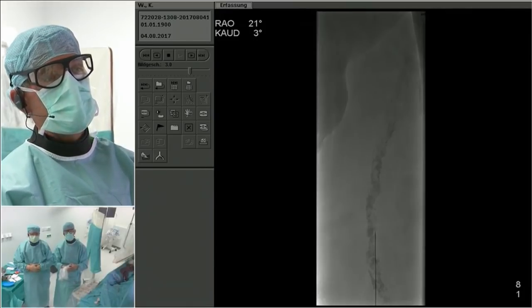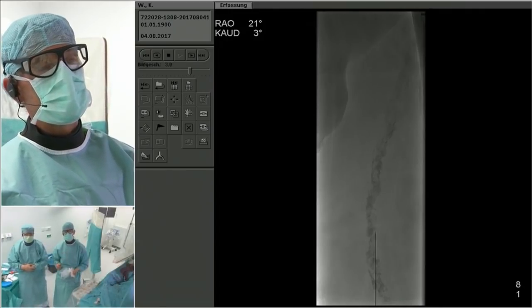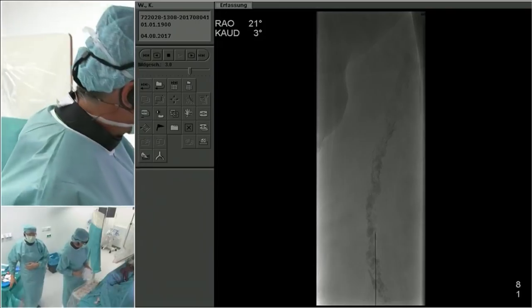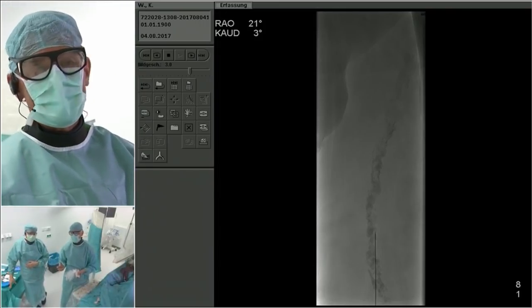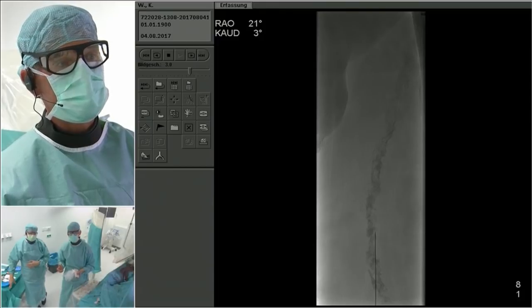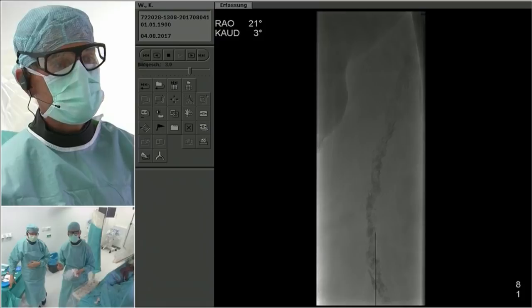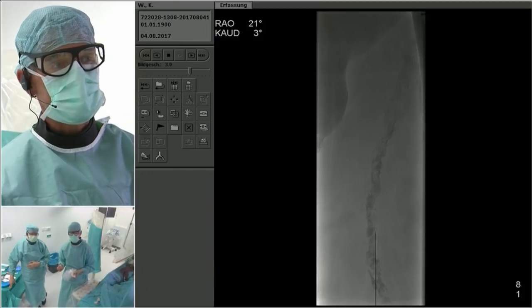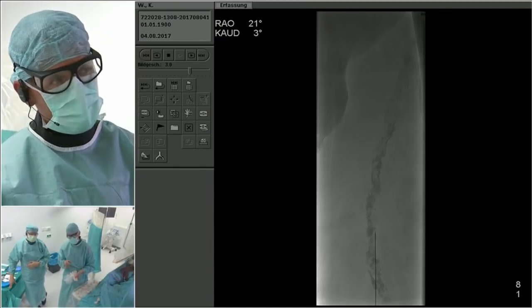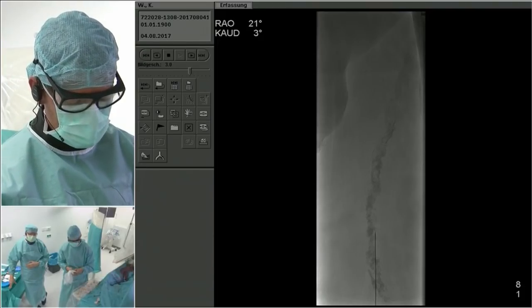Excellent technique. And then, this is something which we nowadays do in all these severely calcified total occlusions. It will probably be quite painful for the patient if we balloon this sufficiently with 5 or 6 millimeter balloons. So what we do is give some local anesthesia around the plug. This is a 9 centimeter 21 gauge needle, and we give 1% lidocaine.